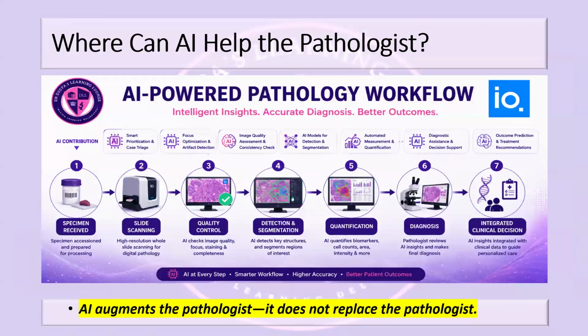Okay. Another thing is, one of the biggest misconceptions about artificial intelligence is that it is a single tool designed to make diagnosis independently, which is what they used to think. That is not what it is. In reality, AI has the potential to assist us at almost every stage of the pathology workflow. It is not only something that is reading your slide. That is not how it is.